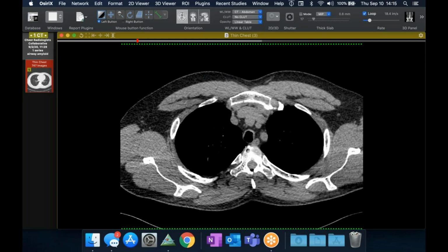Yeah, absolutely. So, all right. Does anybody Santiago Rossi has a couple of great cases of tracheal, like big nodules of amyloid involving the trachea. Yeah, I have a bunch too for the tracheal ones. Yeah, but anyways. All right.